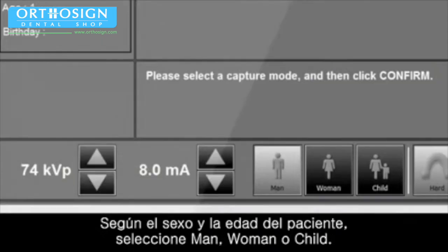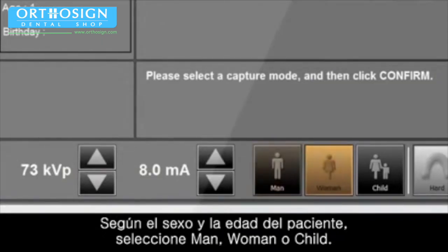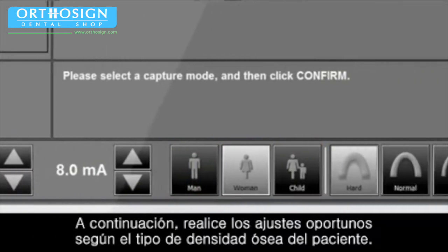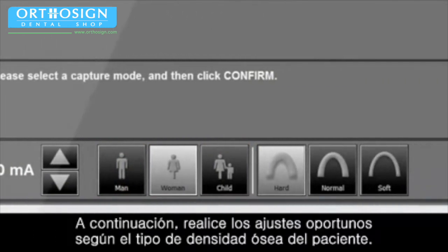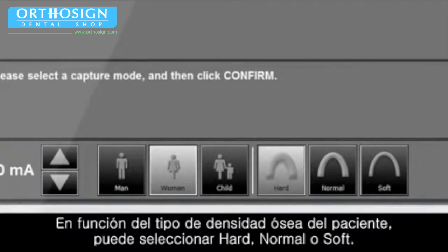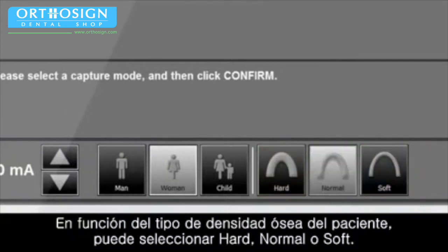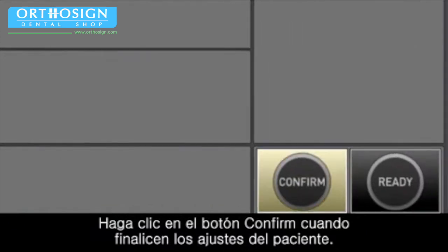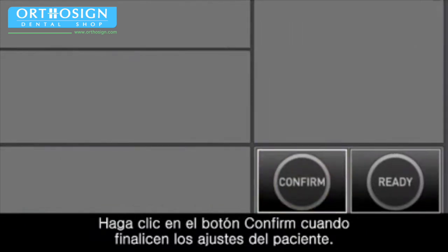According to the patient's gender and age, select man, woman or child. Next, please do the appropriate setting for the patient's bone density type. Depending on the patient's bone density type, you can select hard, normal or soft. Click the confirm button when the patient setting is completed.